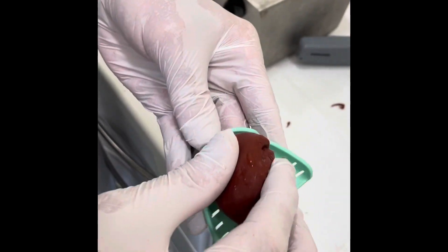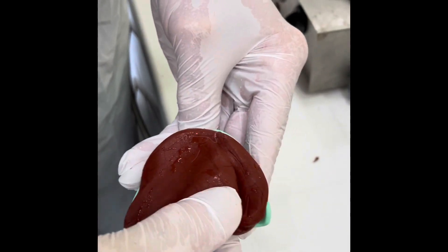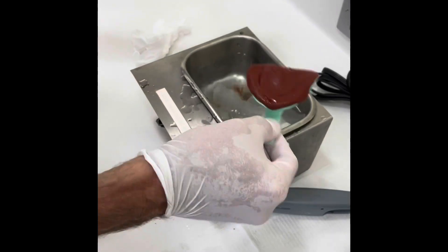Now I'm going to do the upper — same thing. Make sure the tray is approximately the same shape as the current denture and the size. Load it so it's the right shape. Back in the water bath to make sure it's warm, and go to your patient.